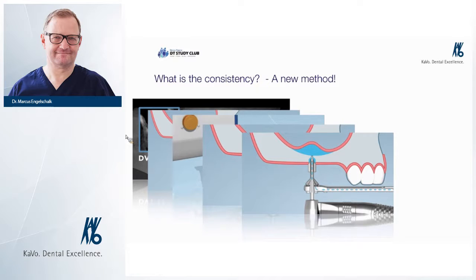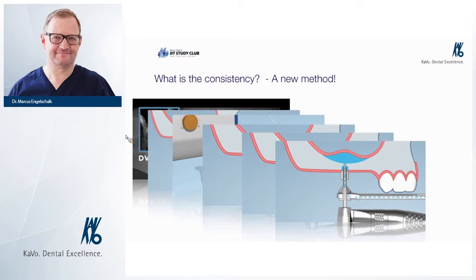As I already mentioned, we need more than 4. We need 5 millimeter at least as a residual bone height, as I already mentioned, because then we reduce the risk factors as we see in the study, and we want to have these heights to bring in our implant with primary stability. So this is 1.5 millimeter residual bone height.